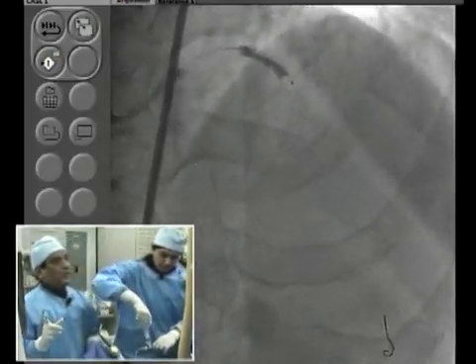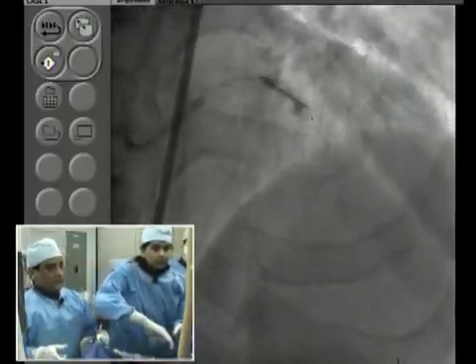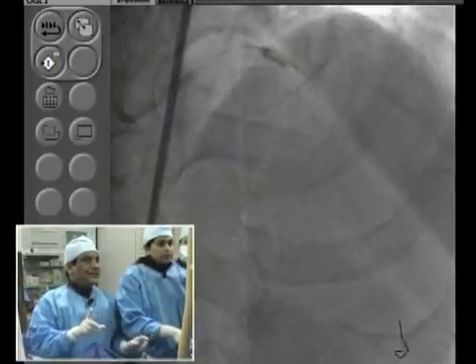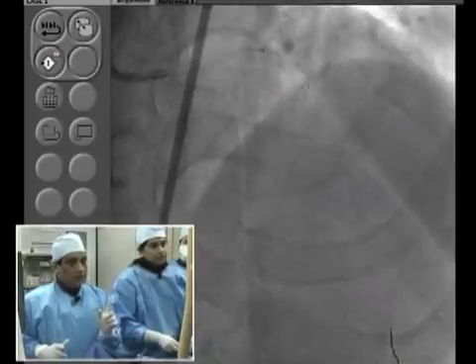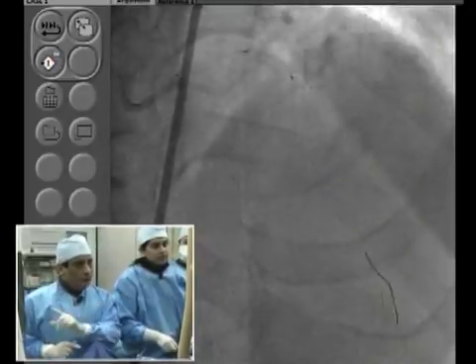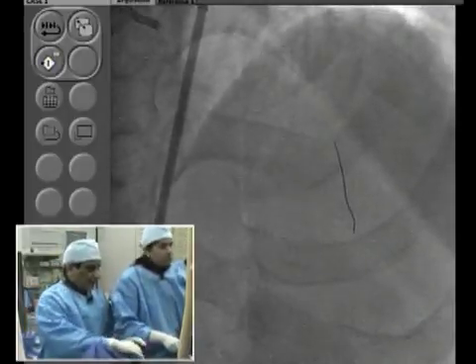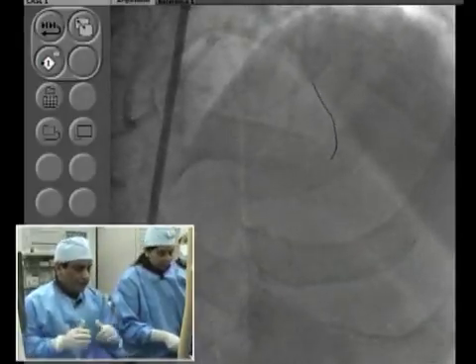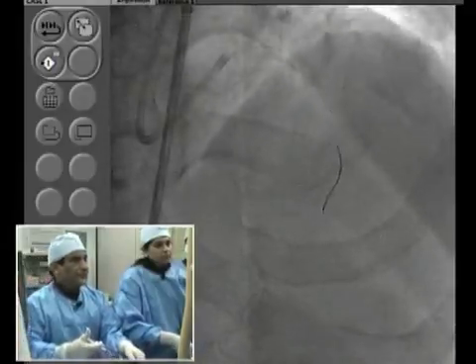But for Taxus, I would say the only indication now is recurrent sirolimus DES restenosis, because the data have shown that everolimus did not have an advantage over the paclitaxel Taxus stent in the diabetic, but not that it was inferior. Based on those data, we are fully comfortable that even in diabetic patients, everolimus, because of the ease of insertion and so on, is the best stent to use for various reasons I mentioned.